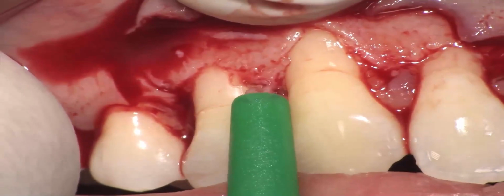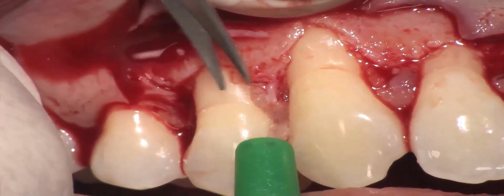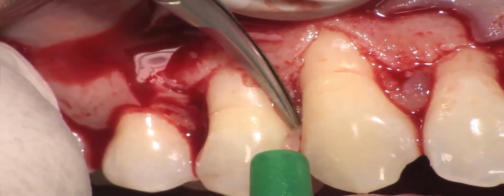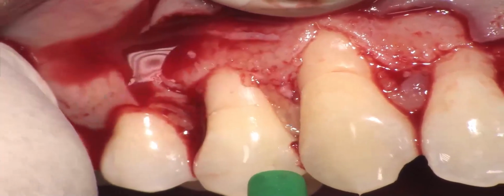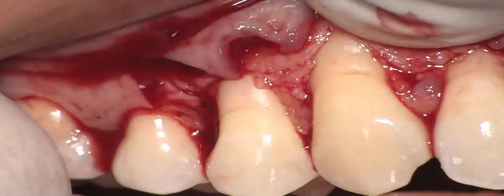preparing this surface. And follow the line I prepare with my blade with the scissors to reach the tip of the papilla. Now we are doing the same on the other papilla.